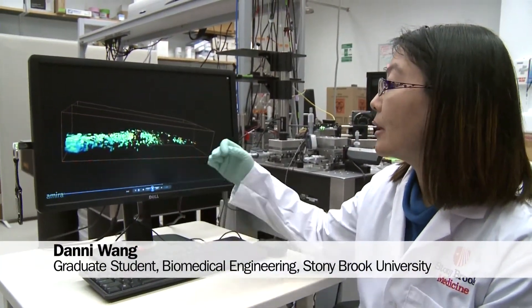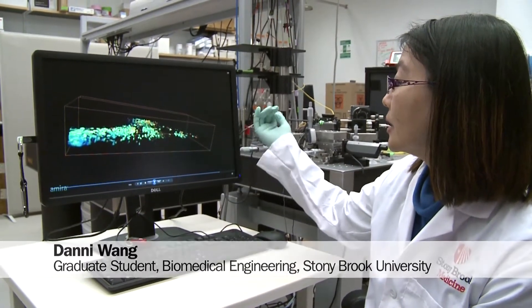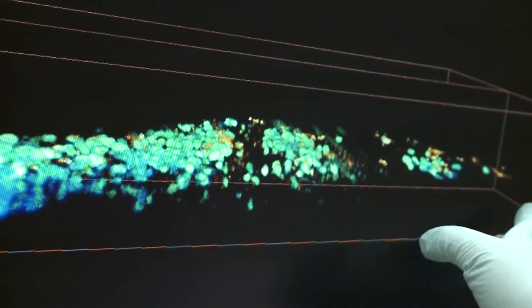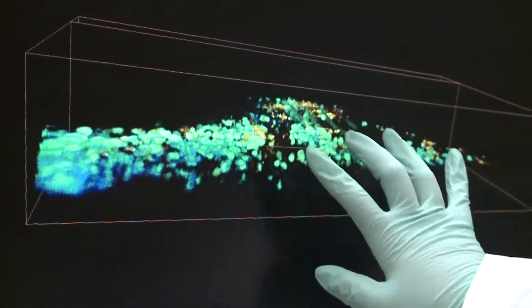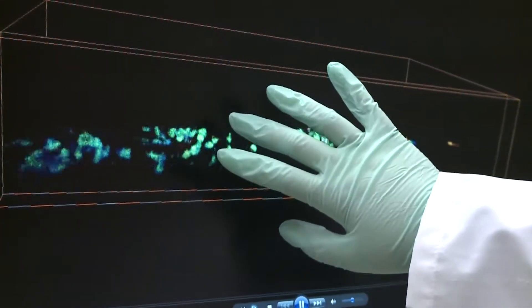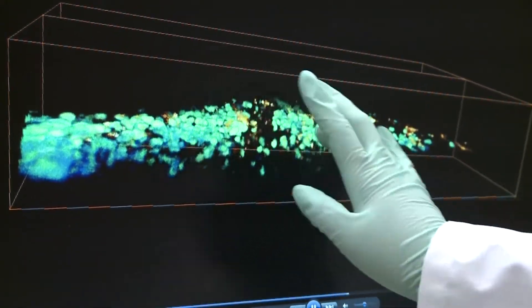We can use light to cut through the tissue and visualize it in three dimensions. What we're looking at is actually a live 3D rendering of the tissue imaging. The darkened background is the normal tissue without tumor, and the green and reddish yellow show the cellular structure of the tumor.